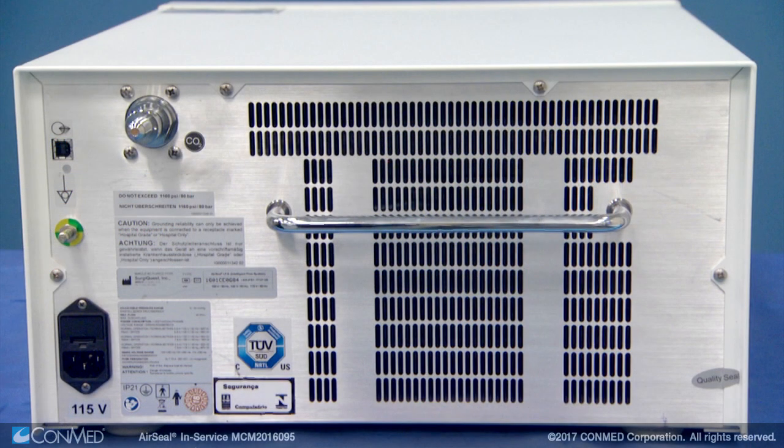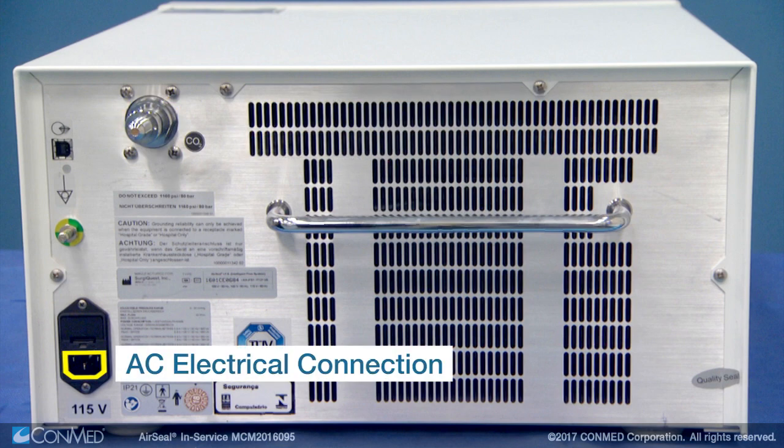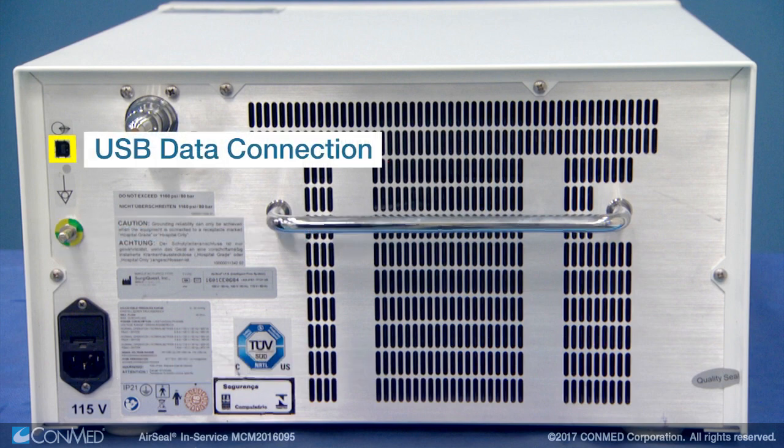Located on the back of the unit, you'll find the gas connection port for house gas or bottle gas, the AC electrical connection, the grounding connection, and the USB data connection.